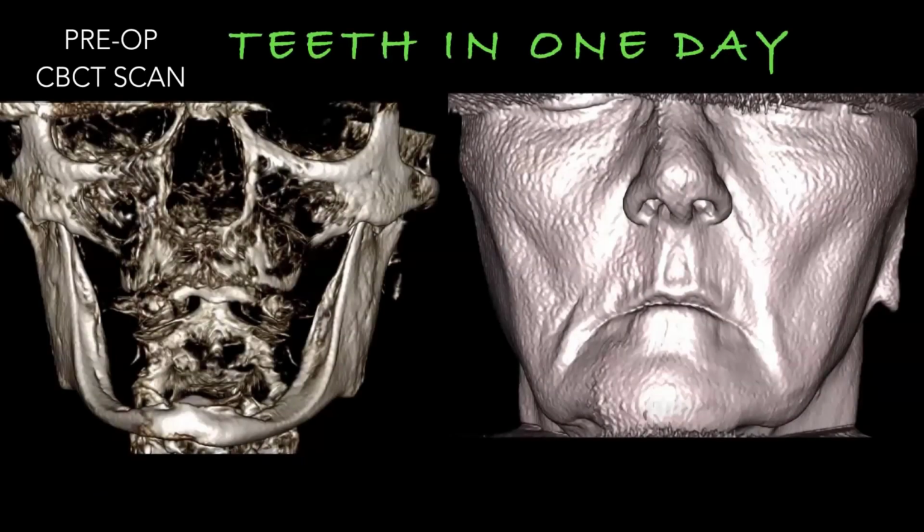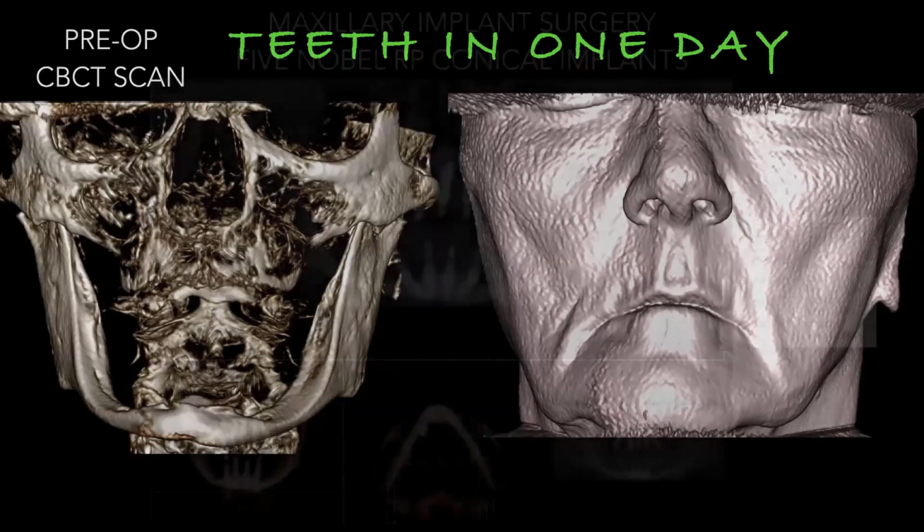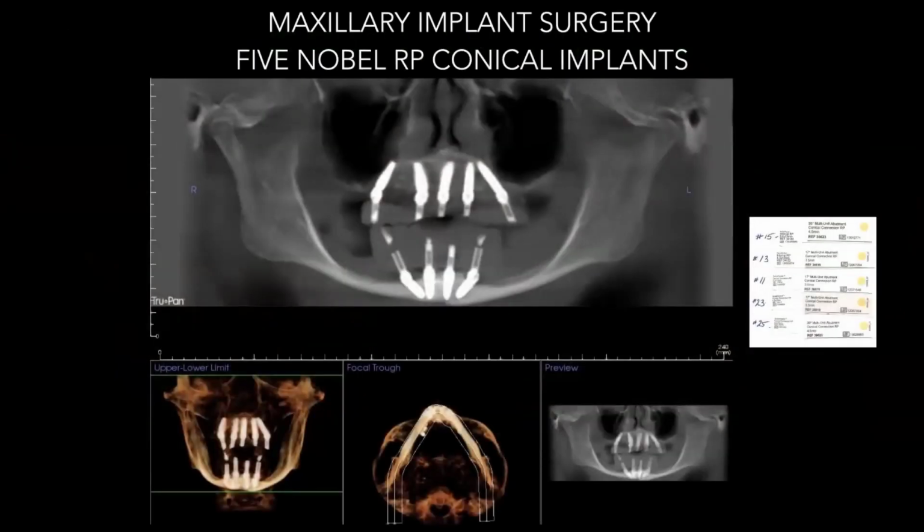Same thing. This image shows you the facial, all from the same scan. You can see the soft tissue, you can see the facial profile, you can see the lips and how things are draping. This allows a lot of the ability for what you can see prosthetically. And then you can see how thin the mandible is. This is really, really difficult. You also can't even see the maxilla. You're seeing right through it. You're right into the spine. And so this is a very, very atrophic case.